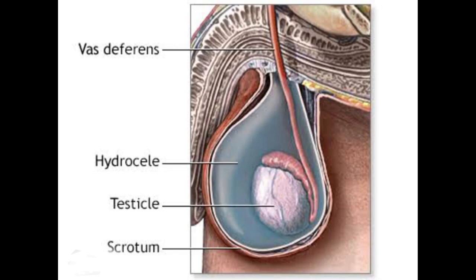You can see the testicle and you can see the scrotum and appreciate the vas deferens. This diagram shows the collection of fluid in between the testicle and the tunica vaginalis, which is called the hydrocele. In infantile hydrocele, the treatment is either operative or conservative.